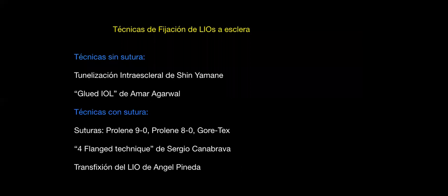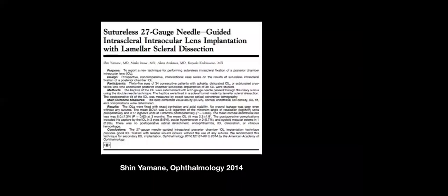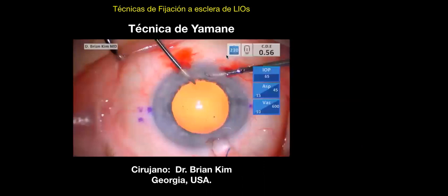El doctor Yamane, ya en el año 2014, publicó en la revista Ophthalmology su técnica para la fijación de lentes plegables a esclera, diseñada básicamente para fijar lentes plegables de tres piezas. Esta cirugía, realizada por el doctor Brian Kim de Estados Unidos, muestra cómo él marca dos milímetros detrás del limbo de cada lado, lado nasal y lado temporal, con una separación de 180 grados, que es donde va a introducir las agujas para entrar en el sulco ciliar.